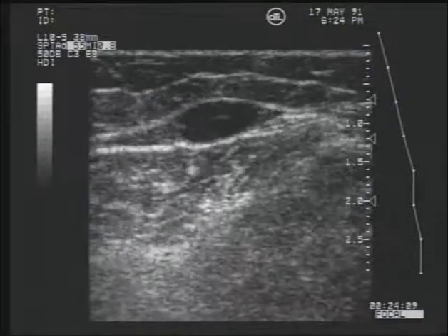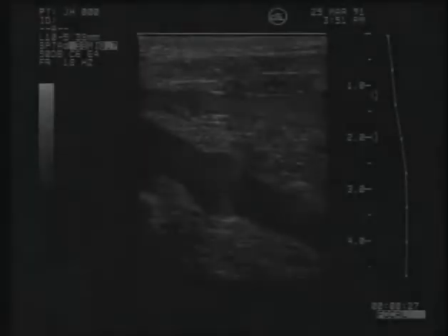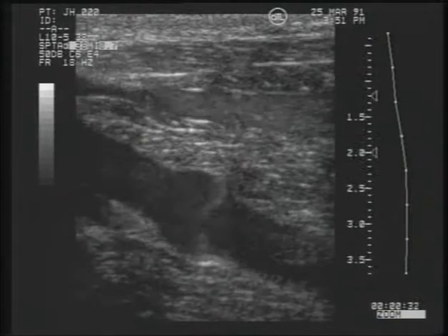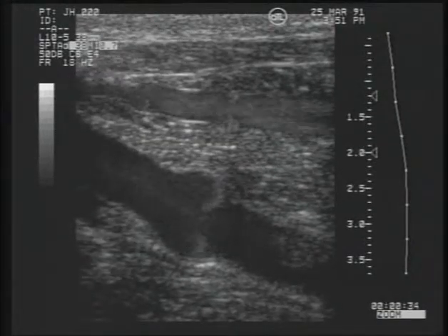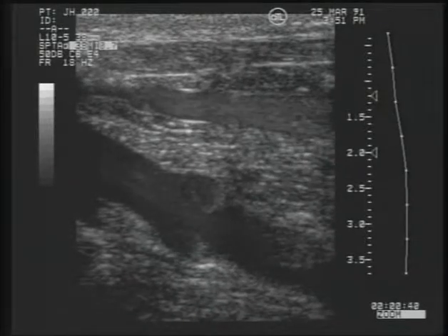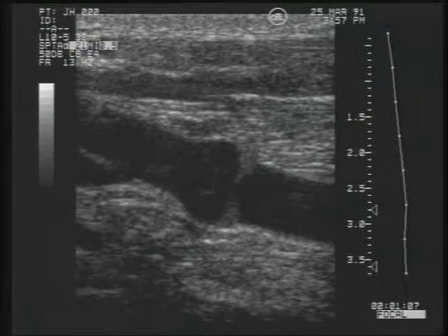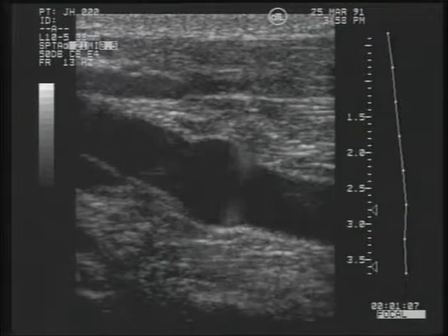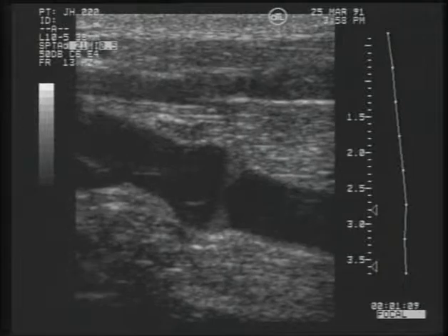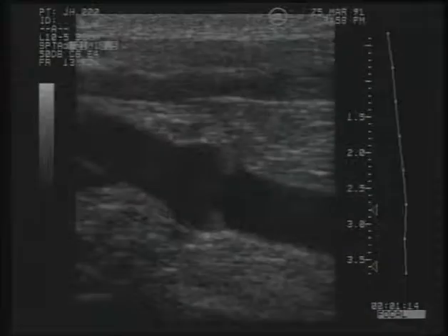Because venous valves are bicuspid, two lines may be seen. The examiner should then rotate the probe into a longitudinal approach to visualize the function of the valve. With passive respiration, the valve leaflets will be open, allowing blood to flow toward the heart. Then the patient should be asked to perform a Valsalva maneuver. The examiner should then observe the vein leaflets as they close as the patient bears down. These observations verify that the structures being visualized are functioning venous valves as opposed to residual venous thrombosis.